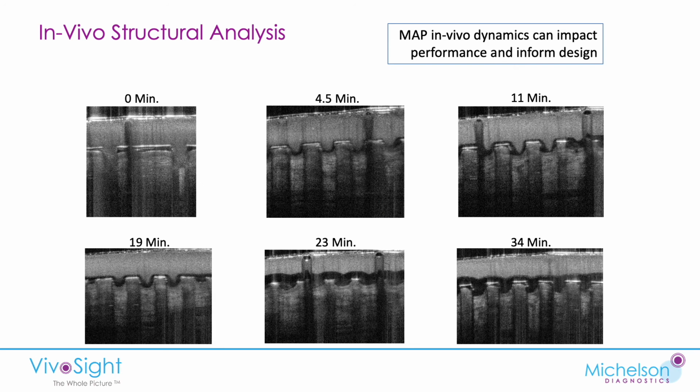And this sequence of images taken, this is actually of a different microneedle array which dissolved rather more rapidly, and you can see the change in the microneedles, immediate blunting, and in fact just after 20 minutes the hydration process was penetrating deep into the substrate, and the microneedles have become very, very broadened.